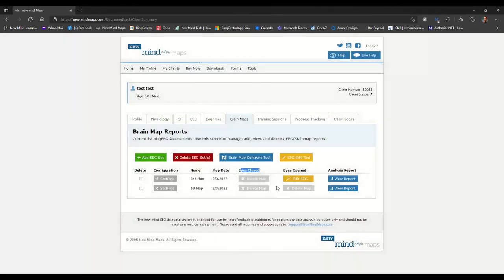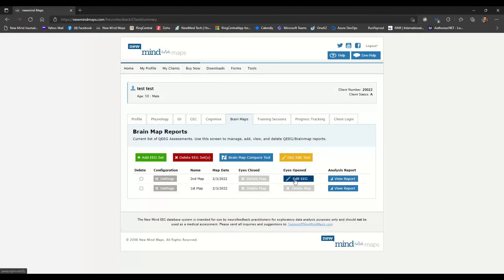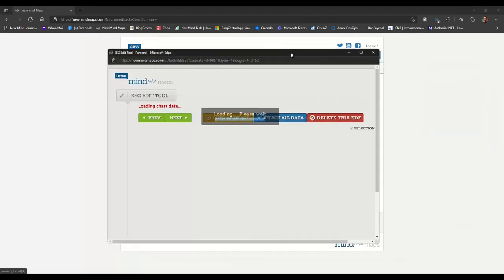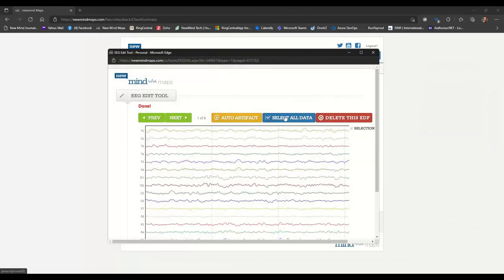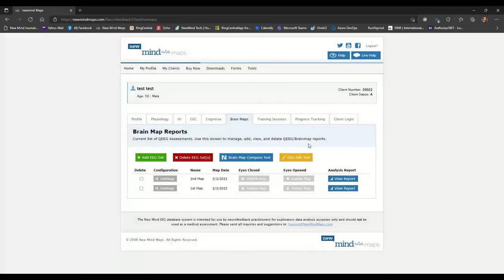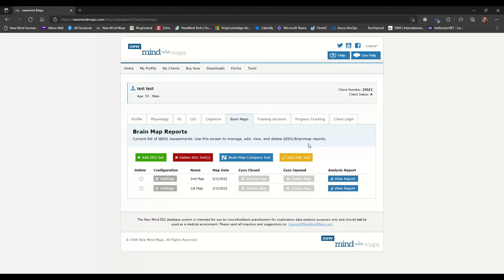Okay, so now I'm going to come over and click on the edit EEG button under eyes open. Again, I'm just going to click select all data. And then we'll wait for this to upload. All right. So now that is how you manually upload your recordings directly to new mind maps if you have the basic software.